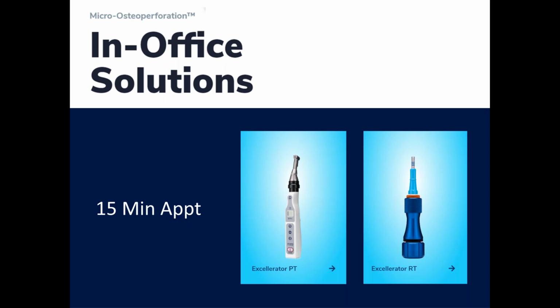I am not going to lie to all of you tonight. I am very good at 1 week aligner changes. That is my sweet spot, and I'll show you why shortly. I don't have to change aligners in 3 to 5 days. Some people really push the envelope and look to do that when they're doing the VPRO or when they're doing PROPEL in the office. But for me, I'm doing 7 days, and I use these to make my cases more predictable so I can get the case finished on time.